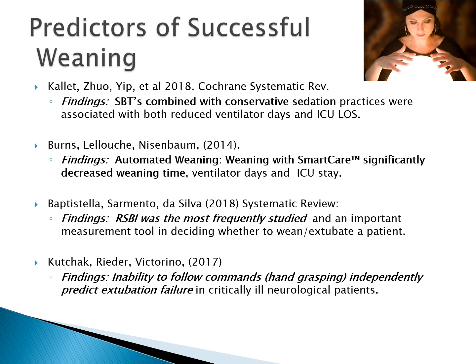Burns, earlier on in 2014, determined that automated weaning with SmartCare, software that will automatically wean the patient by looking at a bunch of different parameters simultaneously, using these computerized algorithms significantly decreased weaning time, ventilator days, and ICU stay.